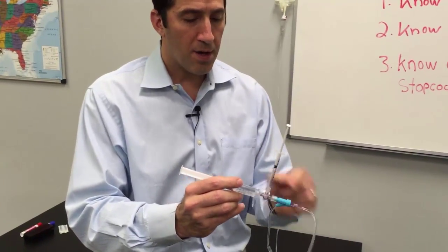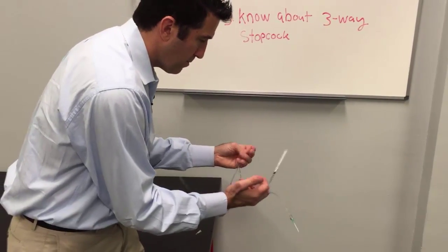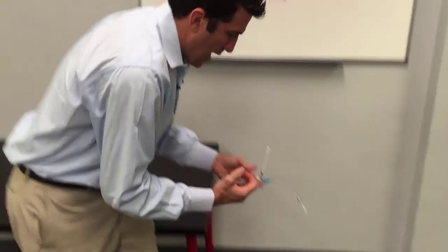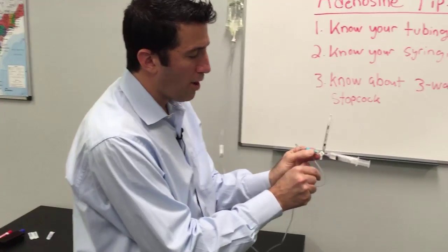Now, because this is open everywhere, you can squirt and then flush right away. You pinch off here, then you're going to flush your medication. You've given all your medication very quickly through a completely open three-way stopcock, because this is off downward.